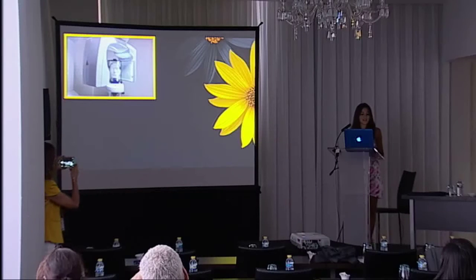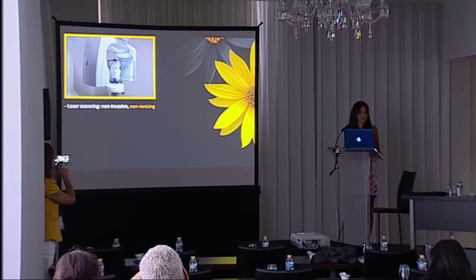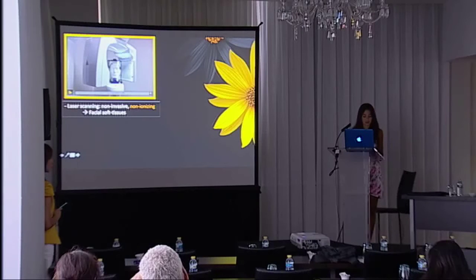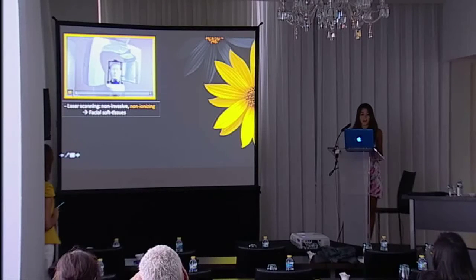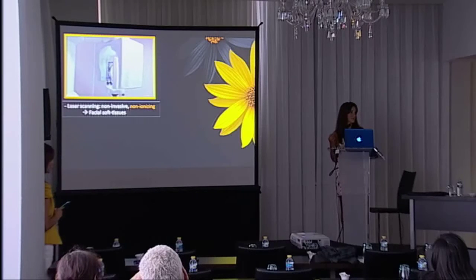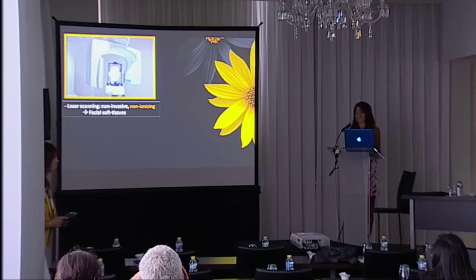Since the 3D facial scanning technology became available, its popularity has rapidly increased. This is mainly due to its non-invasive and non-ionizing imaging technique, which allows a safe and comfortable capture of the facial soft tissues. This category of instrument relies on the simultaneous work of small digital cameras and a low-intensity laser beam that has been shown to cause no risk to the patient's eyes.